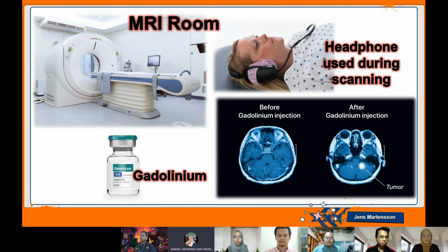When the MRI exam begins, you may breathe normally. However, for certain examinations, it may be necessary for you to hold your breath for a short period of time. During your MRI examination, the MR system operator will be able to speak to you, hear you, and observe you at all times. When the MRI exam is over, you may be asked to wait until the images are examined to determine if more images are needed. After the exam, you have no restriction and can go about your normal activities.